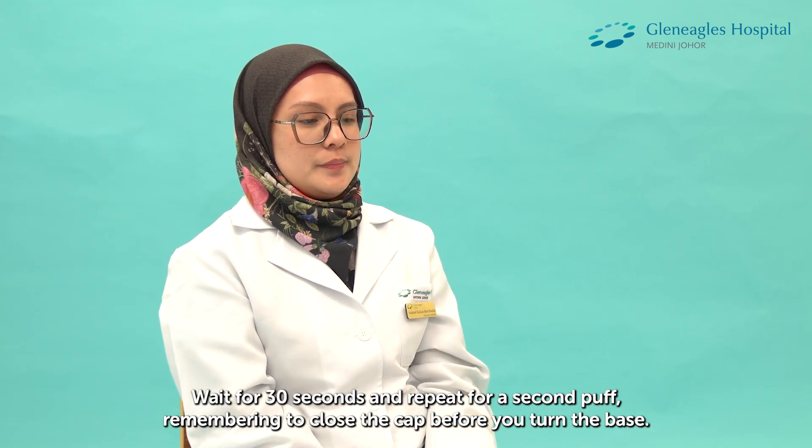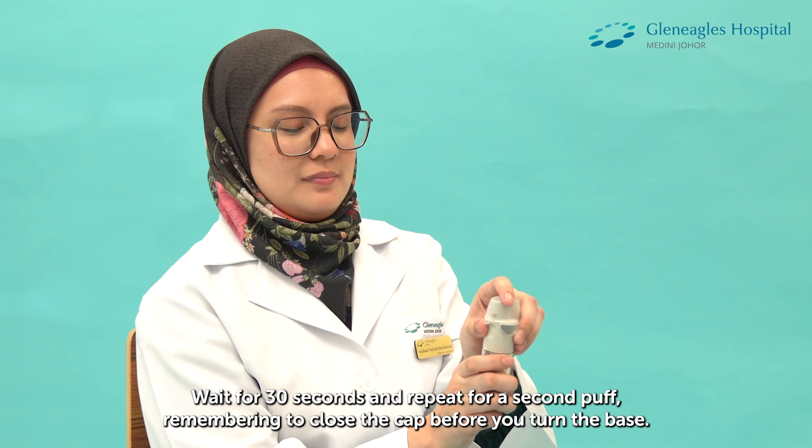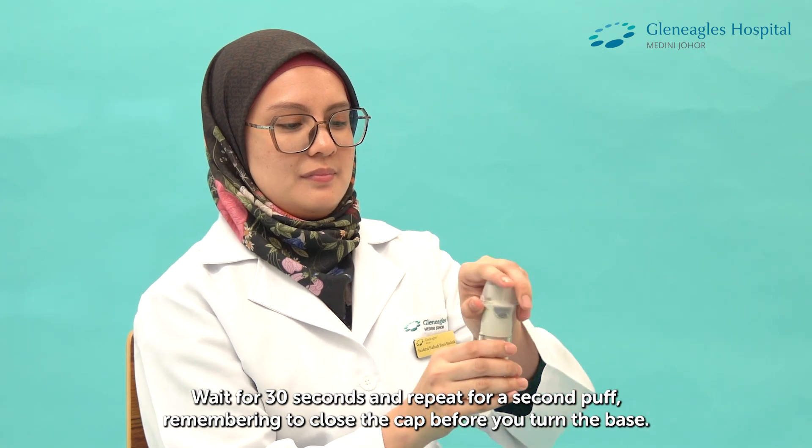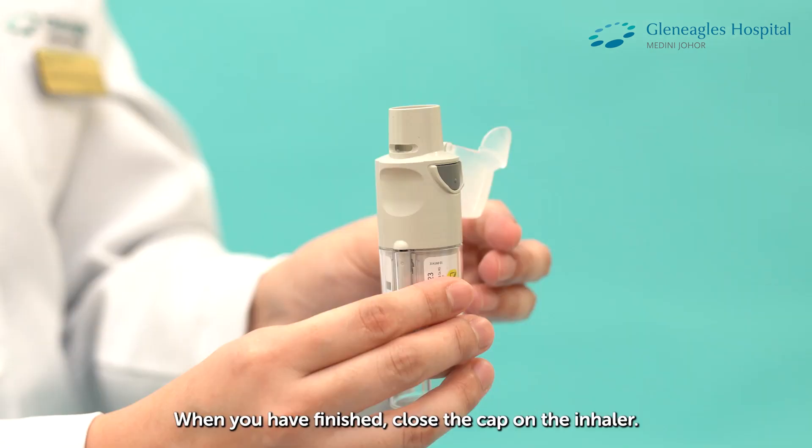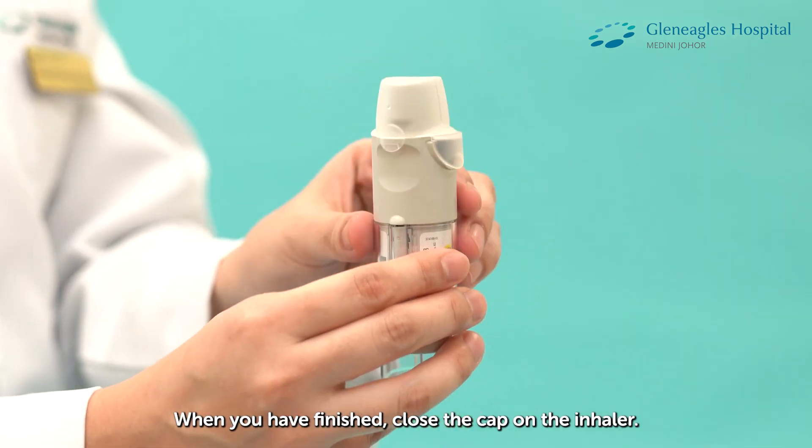Wait for 30 seconds and repeat for a second puff, remembering to close the cap before you turn the base. When you have finished, close the cap of the inhaler.